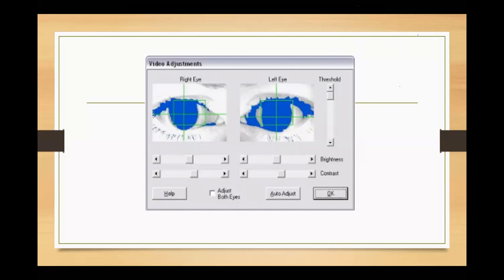Okay, fine. Let's see the comparison of ENG and VNG. In ENG, what is the difficulty? We have to prep the patient. One, we have to place the electrodes. And then we need to clean the electrodes after using them. They will have conduction gel, all those things.